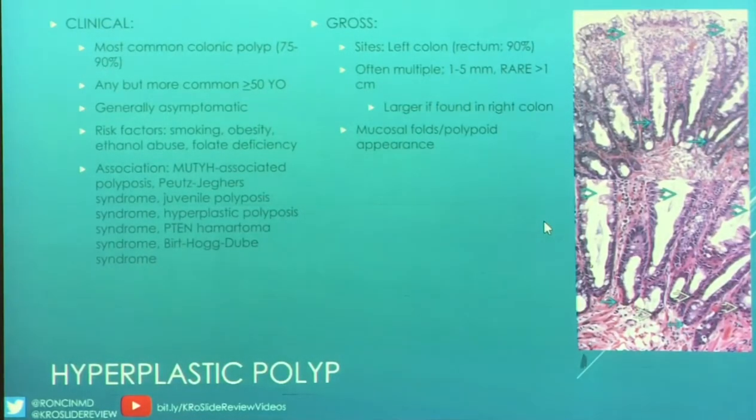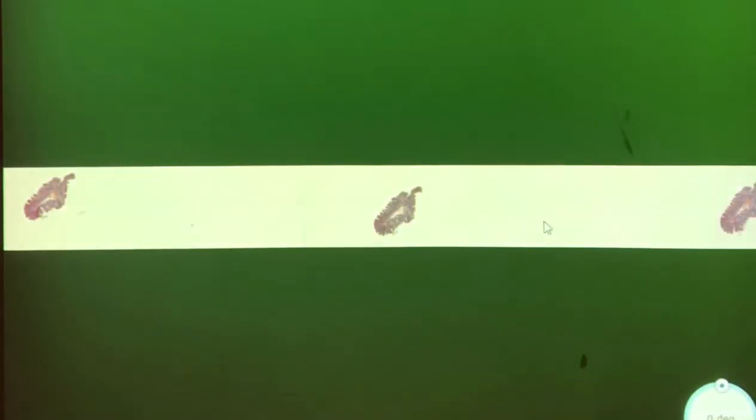Oh, okay, well, that's interesting. This went out of order, so we'll fix that too. It's been a day. So obviously you know the next case is hyperplastic polyps, so I'm expecting everybody to get everything right about those. All right. Do you want to take that? All right. Sorry, I'm a little tethered. It's fine. They took my chair away. That's okay. Oh, no, it's right there. Yeah. Still took it away.